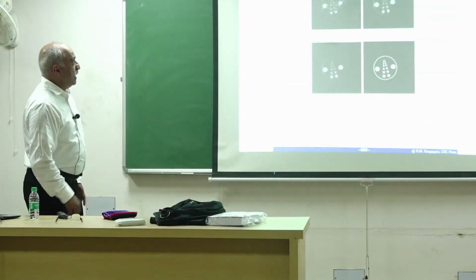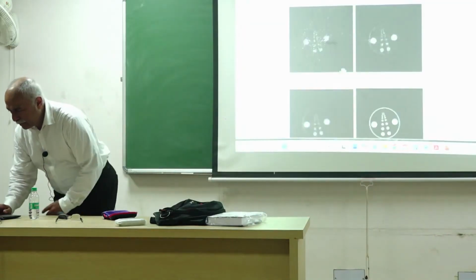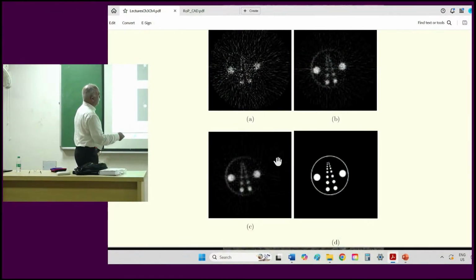So here is an example with that phantom I mentioned. The geometry of the phantom is shown here. There is this drum, plexiglass, and 2 tubes that are filled.